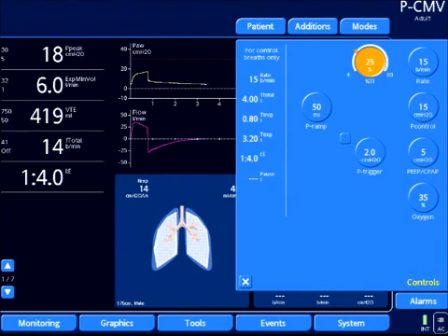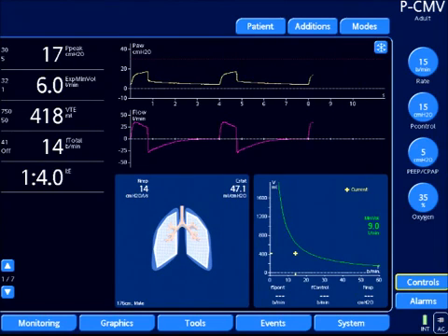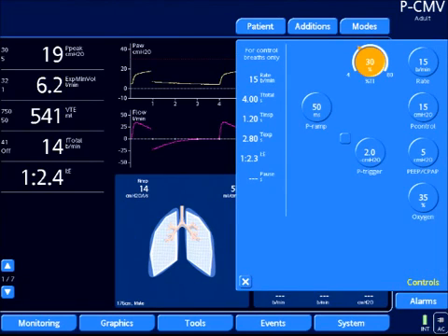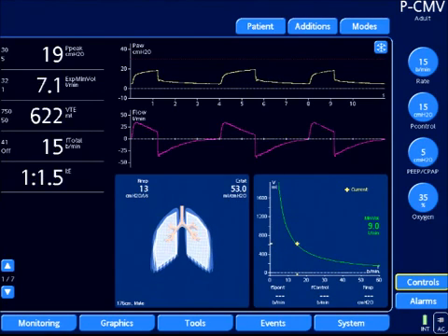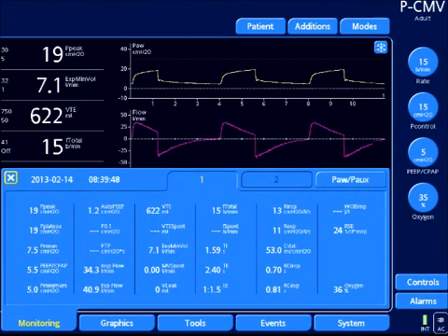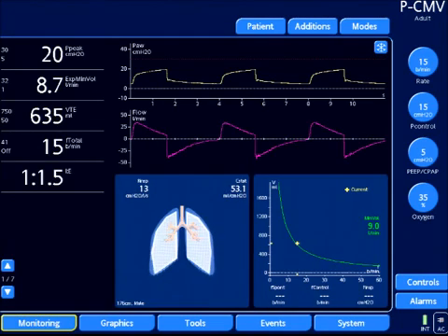So what I'm going to do is lengthen my inspiratory time so my inspiratory flow decreases to baseline. If we look at my purple waveform, it's almost going all the way to baseline. Once it's pretty much a no flow state, I'm going to increase it a little more and look at my waveform. And we look at our monitored values again. As you notice, peak of 19, plateau of 19. However, it probably isn't. I'm going to do the inspiratory hold maneuver again and see the values, because the waveform is not fully decelerating yet.